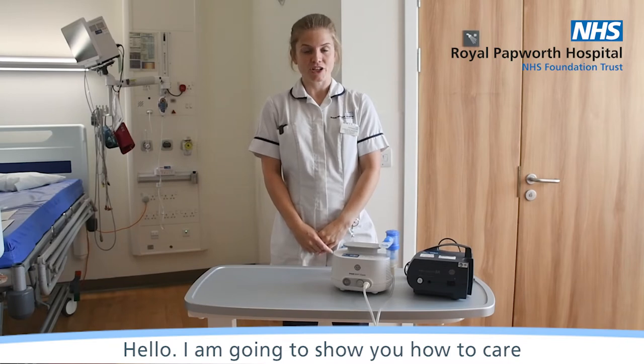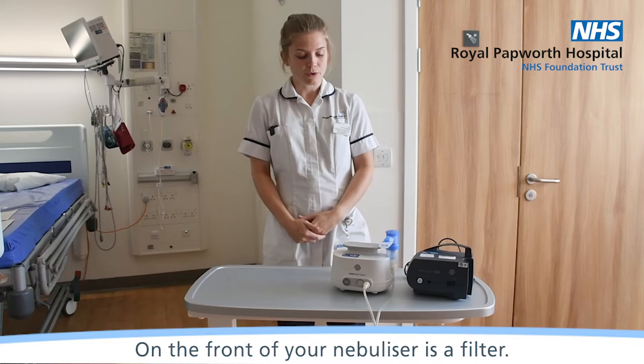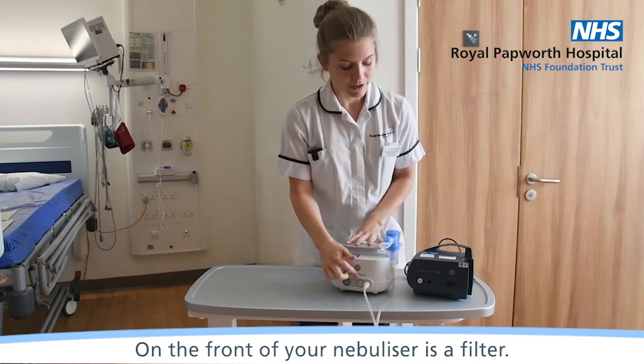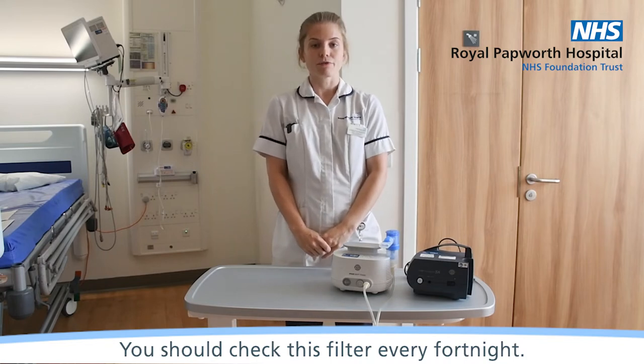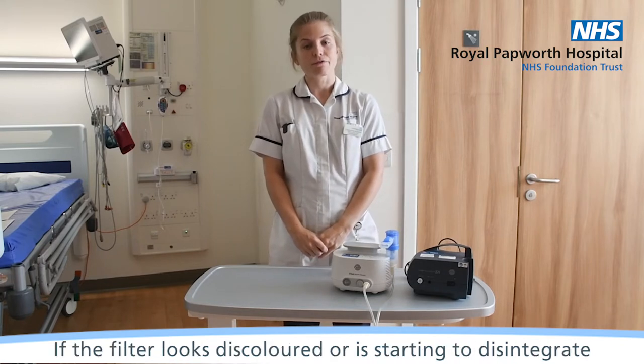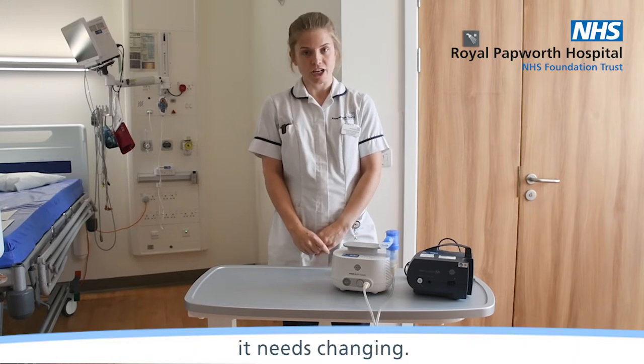Hello, today I'm going to show you how to care for your Pari nebuliser. On the front of your nebuliser is a filter. You should check this filter every fortnight. If the filter looks discoloured or is starting to disintegrate, it needs changing.